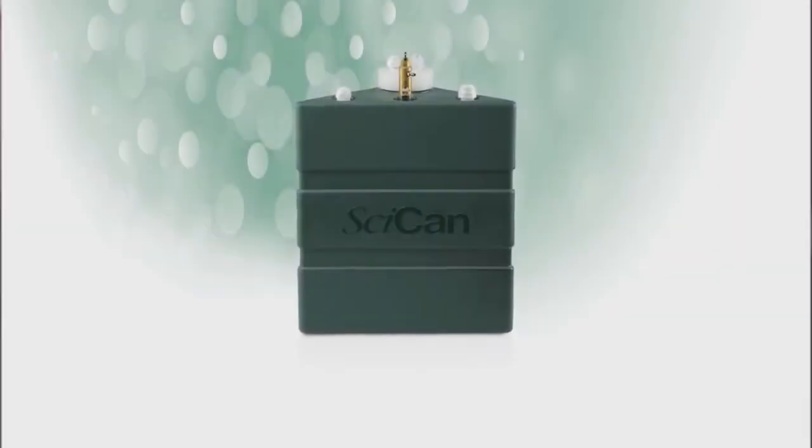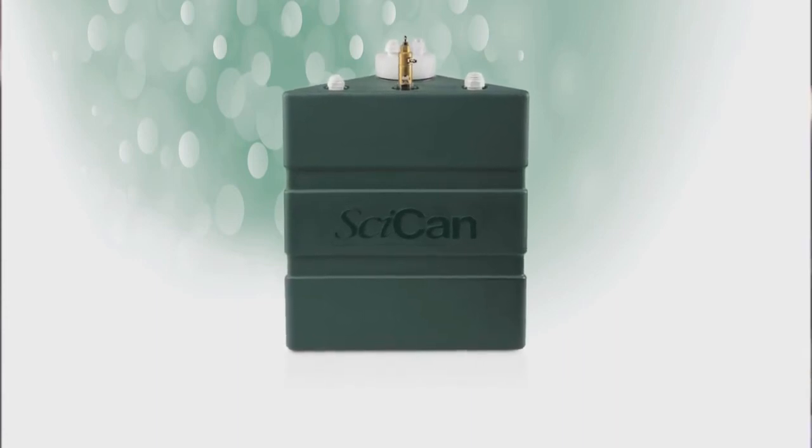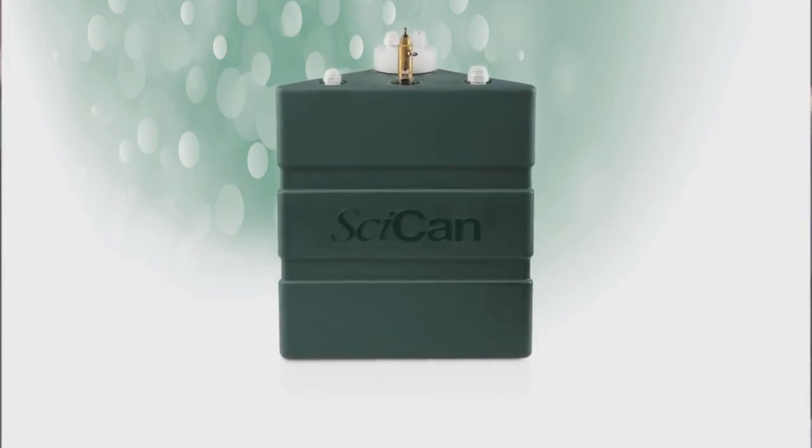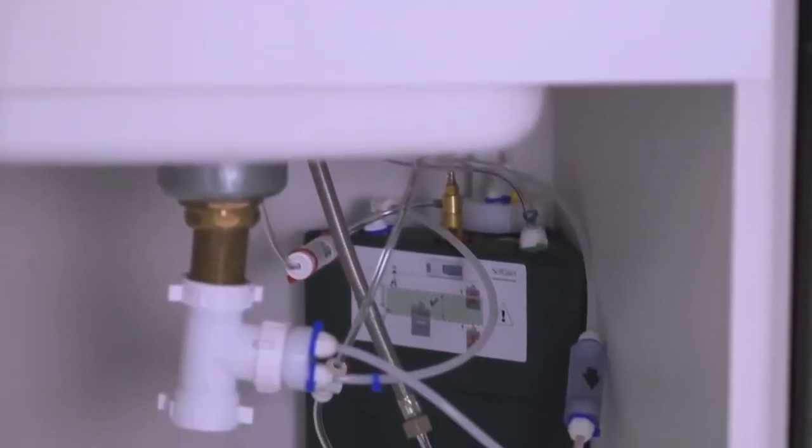Another optional new feature is our StatFlow waste bottle. Because all Statums use fresh, steam-distilled water on each cycle for gentler sterilization and better performance, the new StatFlow waste bottle is a plumbed, permanent, under-the-sink option to handle all waste water. Imagine — no cleaning or dumping of the waste water bottle, ever.